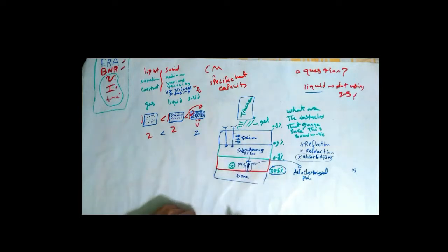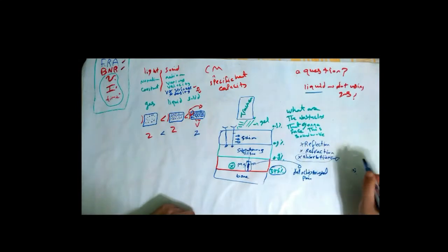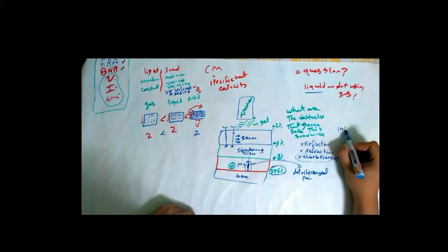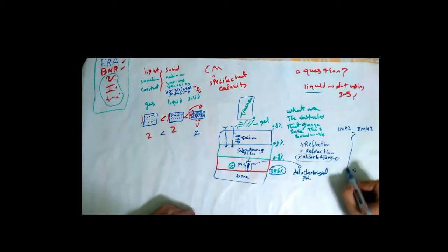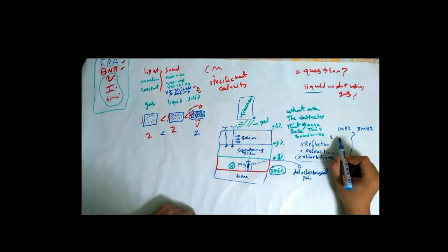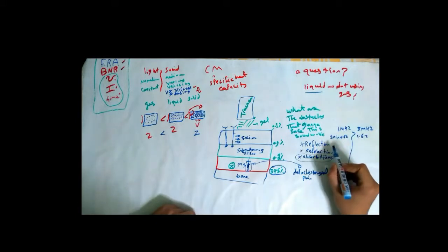So absorption is different with 1 megahertz and 3 megahertz. In 1 megahertz, skin absorption is 0.62, while in 3 megahertz it is 1.62.